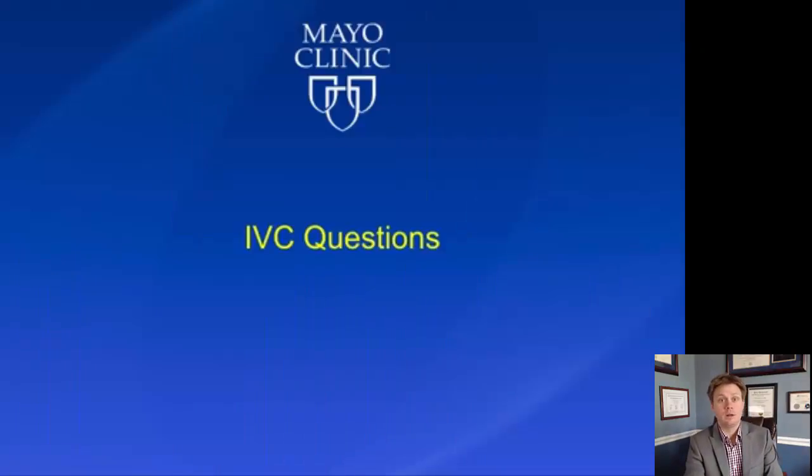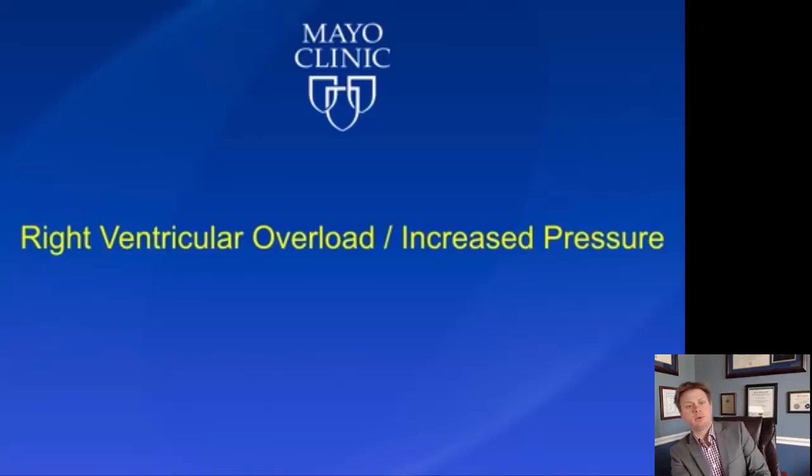All right, moving on. Right ventricular overload and increased pressure is another common reason that my colleagues will ask me to potentially do a bedside echo, because they're concerned about the patient having a pulmonary embolism. Now, while this is a useful screening tool and at some points has relatively good specificity, it has terrible sensitivity for the risk stratification of pulmonary embolism.